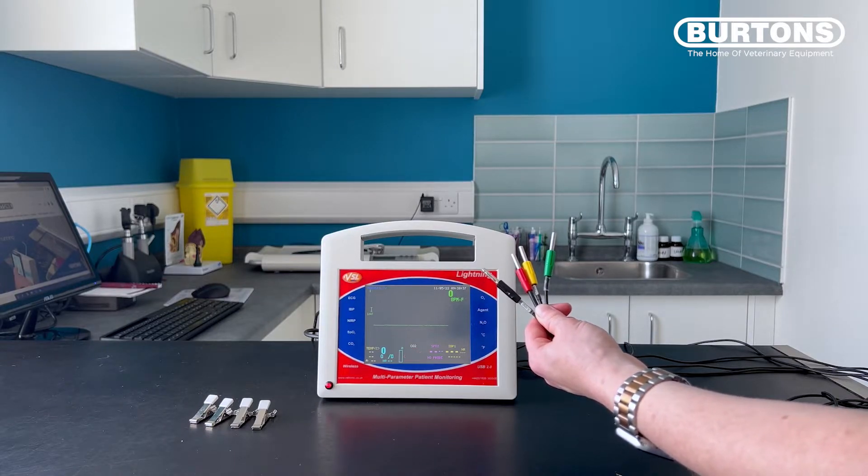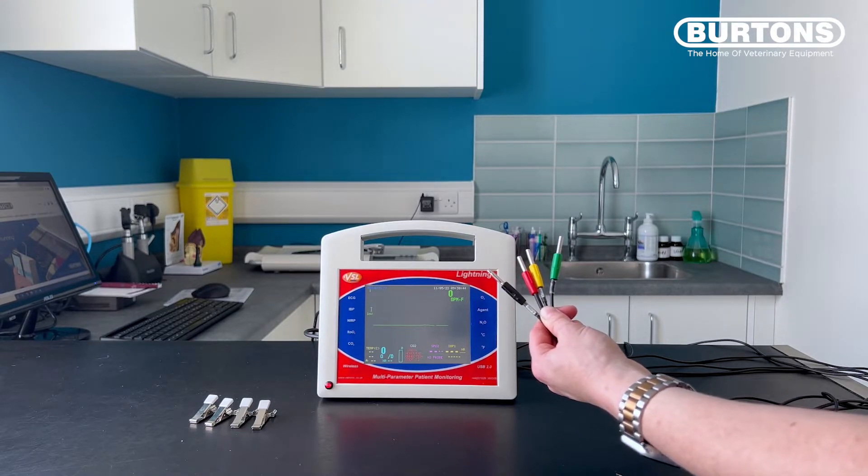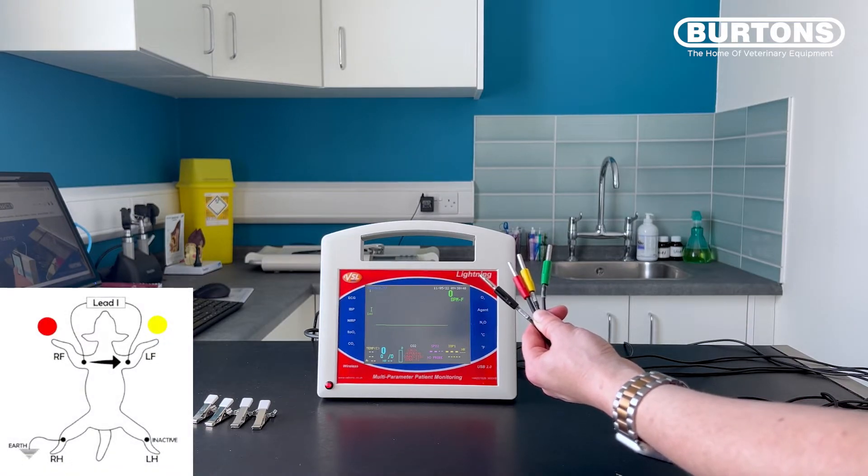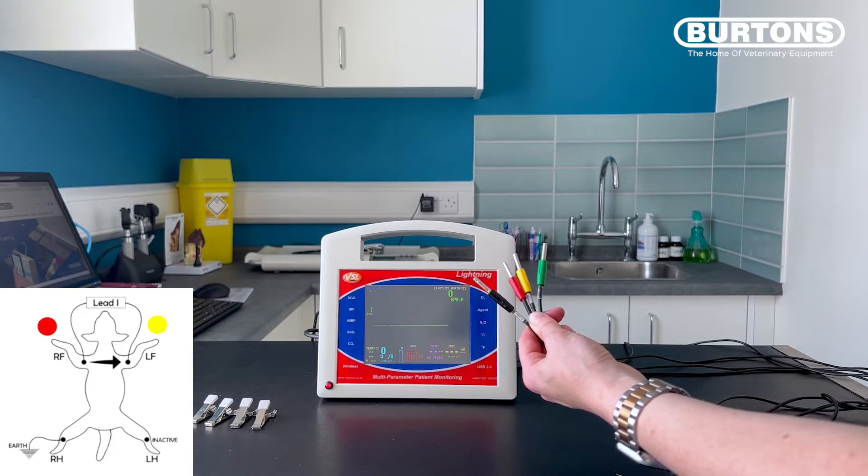Therefore, if you have interference on leads one, two and three, it is likely that your black reference cable is broken. In lead one, the active electrodes are red and yellow. Therefore, if I touch them and introduce a signal, we should get interference on the trace.